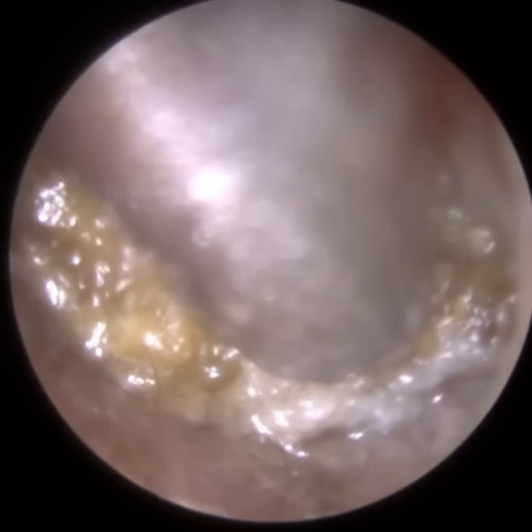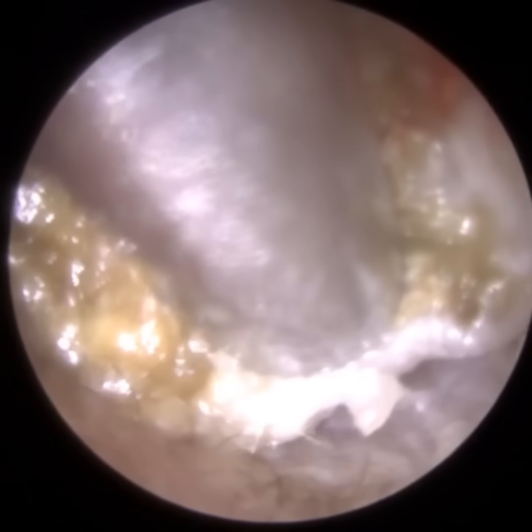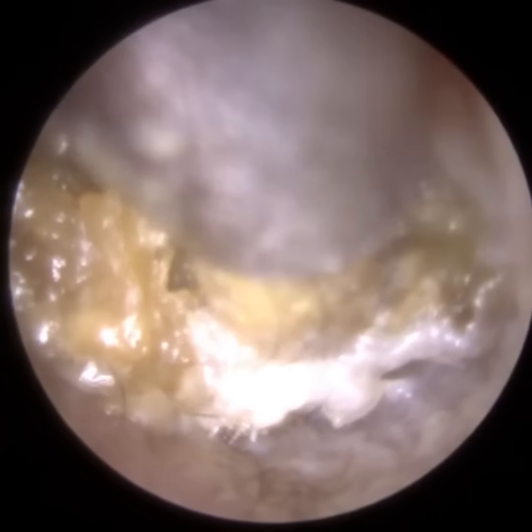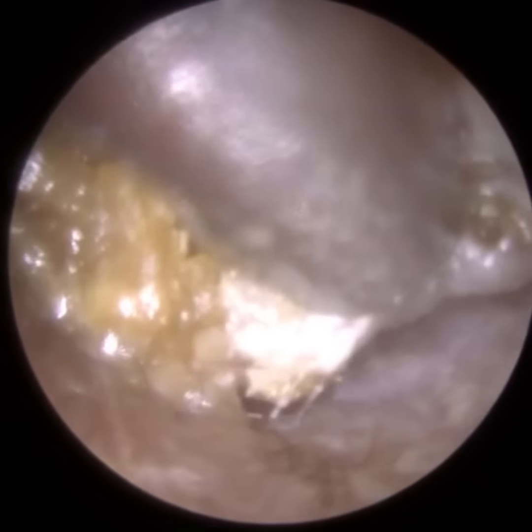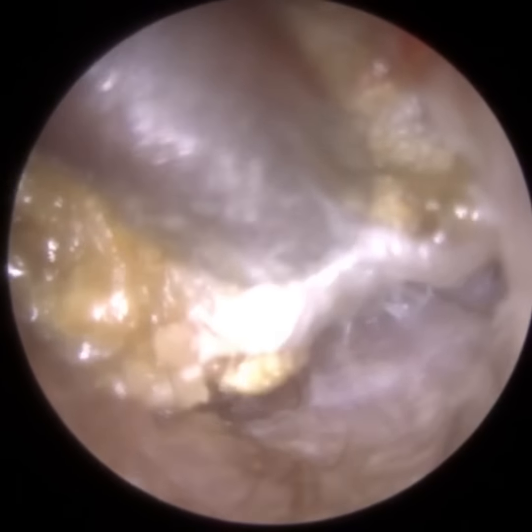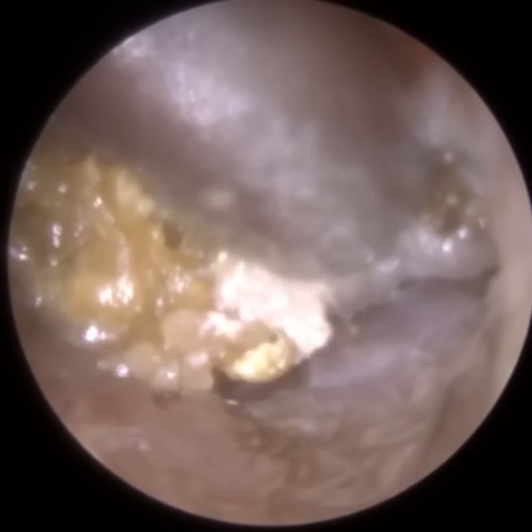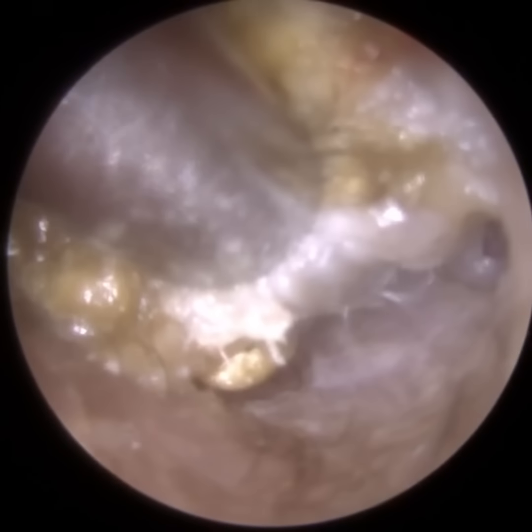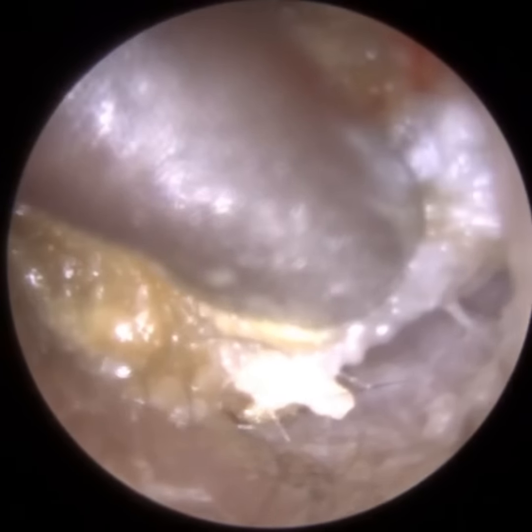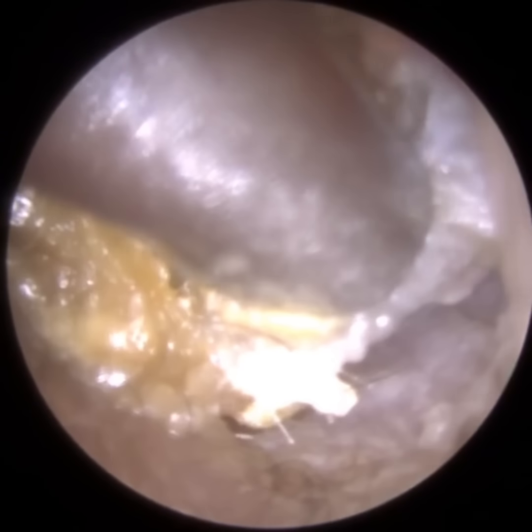So I've just gone back in with the suction initially. And another way to describe this, it's almost like chewing gum. Dry chewing gum at the bottom of your sole and your foot. And the patient came as an emergency today, couldn't sleep last night. So again, one of the hallmarks of keratosis obturans is severe pain, and it kept him up all night.